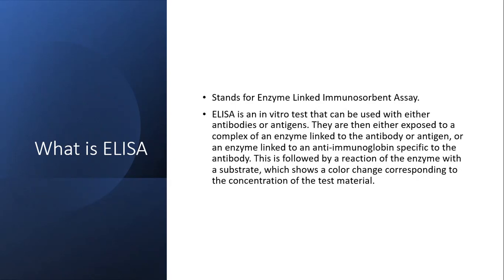For instance, if the color change is shown, like if the test tube turns blue or whatever, they would have the virus. But if nothing changes, if there's no visible color change in the test material, then they probably don't have the virus.